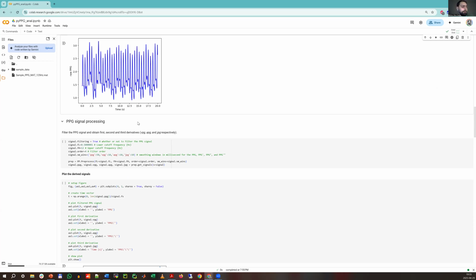As James already mentioned, we work mainly with finger PPG signals, and we validated our toolbox mainly for this. But in general, there is an optimal frequency band for the PPG signal.